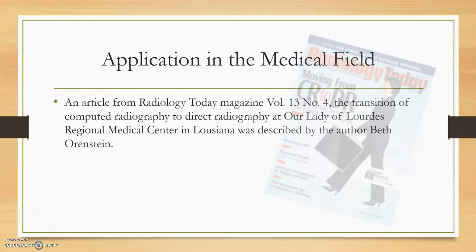The director of radiology in that facility had been in contact with General Electric Healthcare for the conversion for about 4 years because they didn't quite have that exact setup available yet that they wanted. That's one downside, aside from the high cost of DR, is that since it's such a new technology, the software and the specific setups may not be available yet that all facilities want.